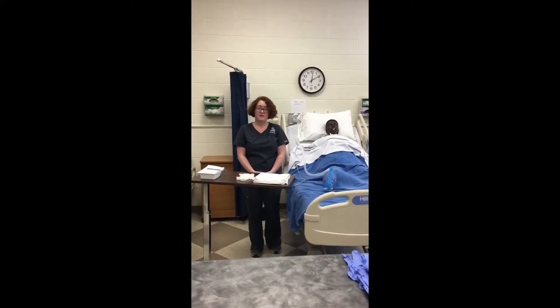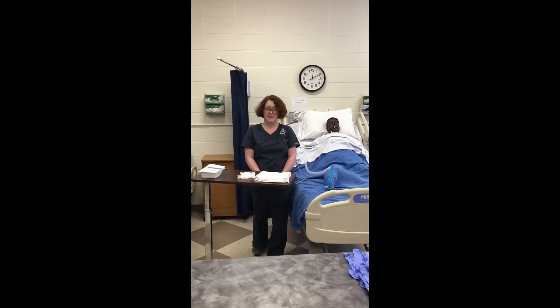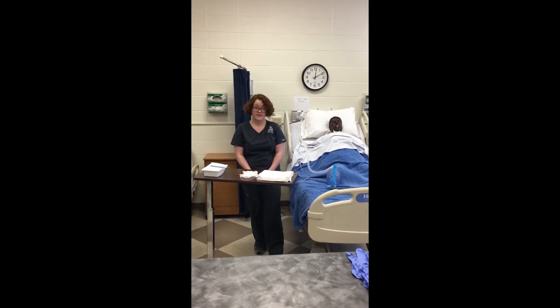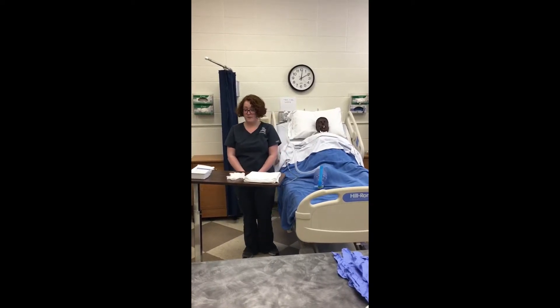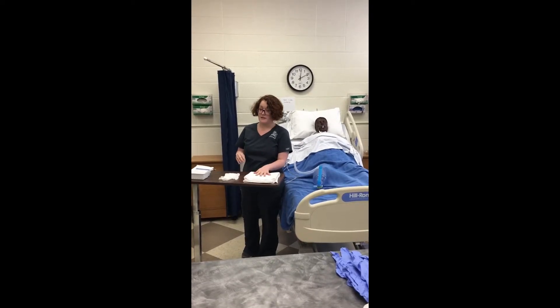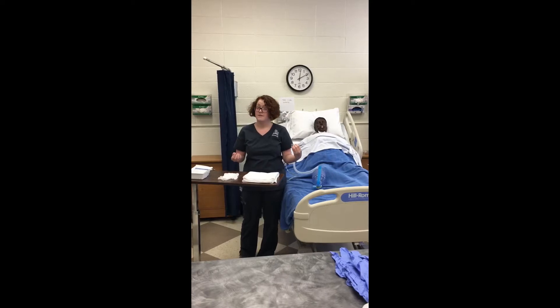My name is Taylor Erfling. I'm a first semester nursing student. Today is April 6th, it's about 12:10 in the afternoon, and I'm going to be performing endotracheal suctioning today. First, I'm going to assess my client for the need for suctioning. Then I'm going to assemble my equipment: I have a sterile suction catheter kit, clean gloves, a towel if need be, and goggles and gown if necessary.